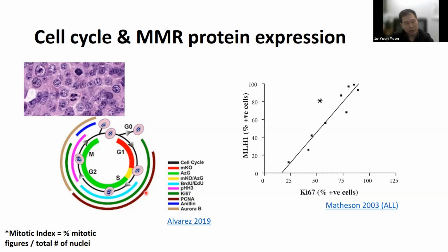So we use that in pathology quite a bit. Here's another marker, phosphohistone H3, that we use in some of the labs here, but not all the pathology labs have that. That's more towards the G2/M phase of the cell cycle.